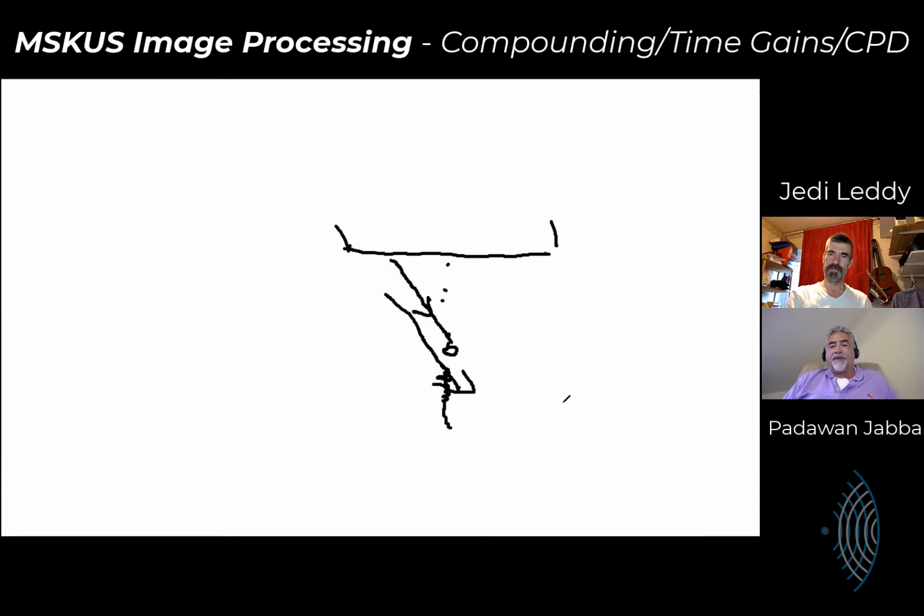That's right. I'm with you now. So you get a better picture with the compounding because you can see what's behind the calcific thing. But you don't get a mathematical number. You could see that was calcium by the fact that it was a brightness 10 or 8, as opposed to the soft tissue that is brightness 2. However, on most systems, most of the time, you can't see the difference between an 8 and a 4. Have I lost you?